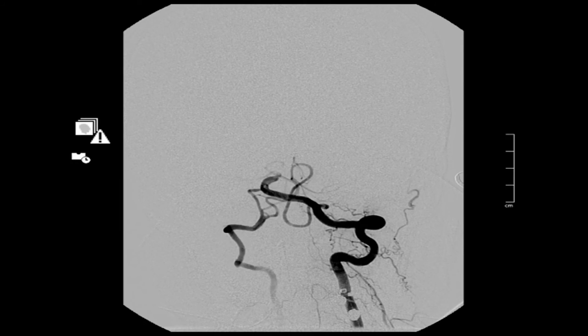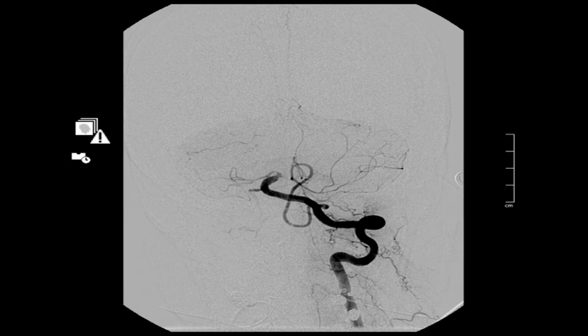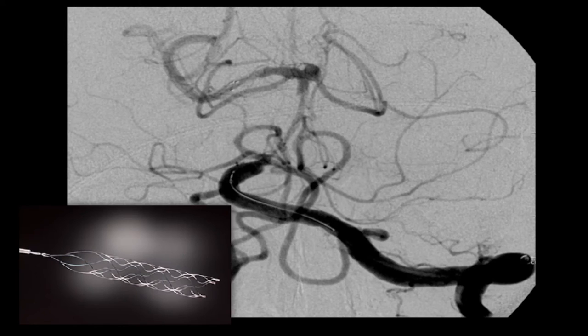This one is a little different. So it's a basilar occlusion. The vertebral artery is coming up this way. Basilar artery should be right here. This is in the back part of the brain. You can see the cerebellum outlined right here from the branches that are actually perfusing. So first thing I did was use a Solitaire device. And you can see the Solitaire coming up this way, all the way around like that. And there's the end of it right there.